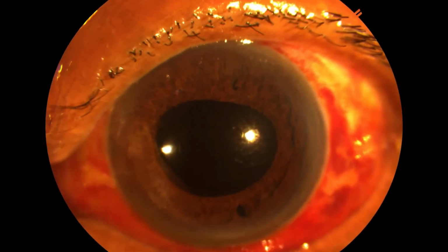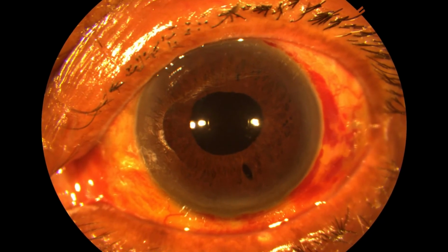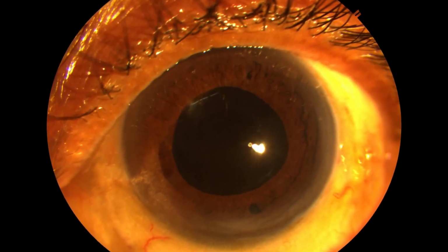This is the patient on the next post-op day, and the patient gained 6/9 vision in the coming week, and the final picture at 4 weeks showed everything in place, IOL nicely centered.